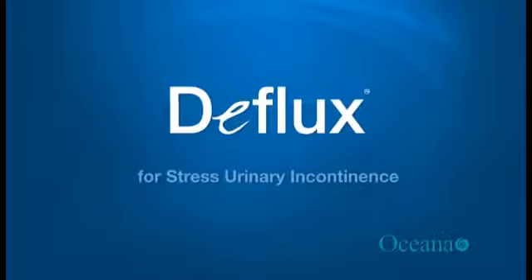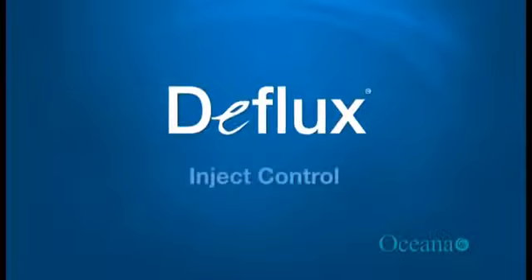Welcome to this short animation which demonstrates how Deflux is used to help relieve the symptoms of stress urinary incontinence.